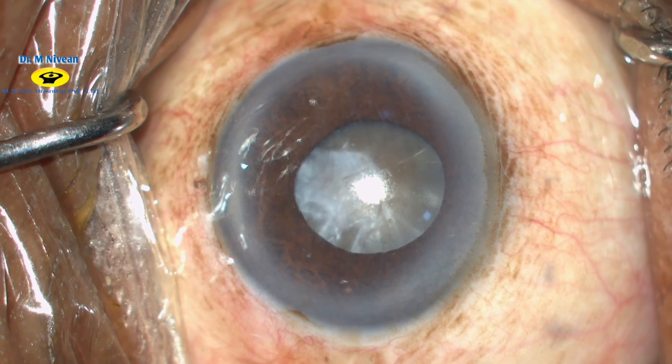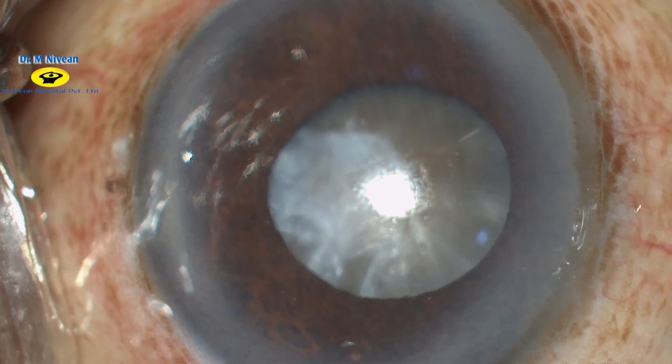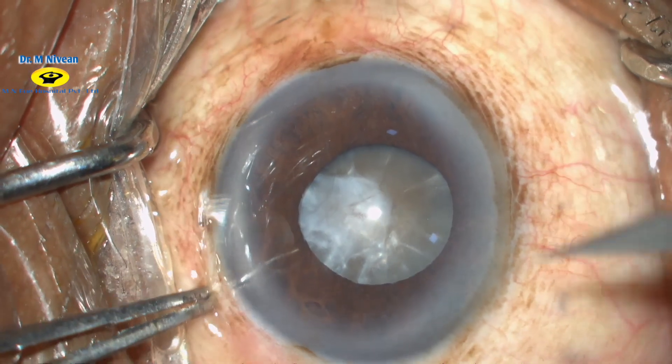This is a case of a hard brown mature cataract with a calcified anterior fibrous capsule and a relatively small pupil. There are atrophic patches on the iris.